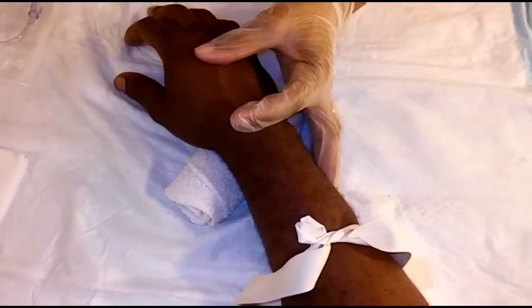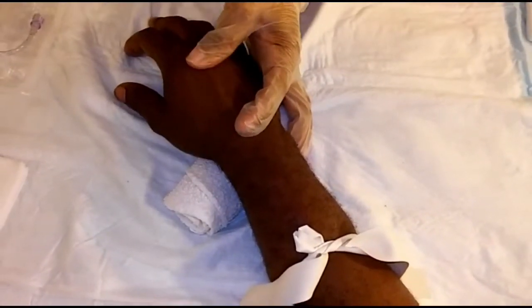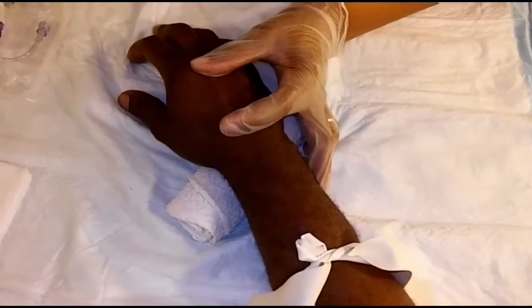Now you want to gently place your thumb over the vein and gently stretch the skin against the direction of the insertion site. Ask the patient to relax his hand and let him know he might feel a quick pinch.